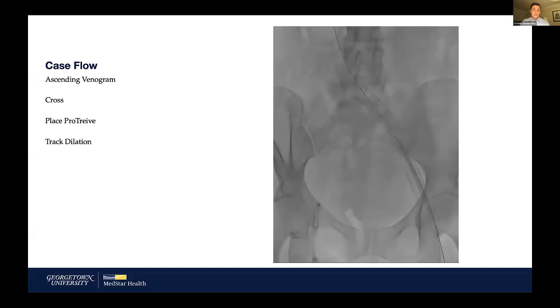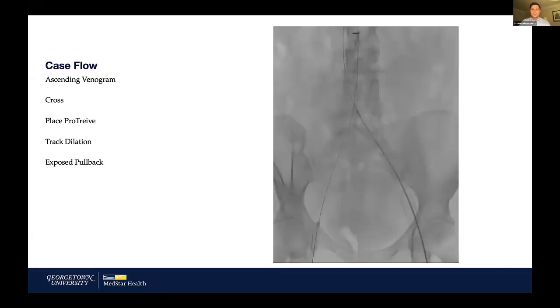I chose a 4 or 6 millimeter balloon and then dilated with an 8 millimeter balloon. Afterwards, we unsheatheed the device — this is our first unsheathing. To make sure the device passes smoothly through the stent, since you will be moving the device aggressively back and forth, you want to confirm the device passes smoothly in its unsheathed fashion. So this is a pullback and advancement unsheathed to verify the device passes.